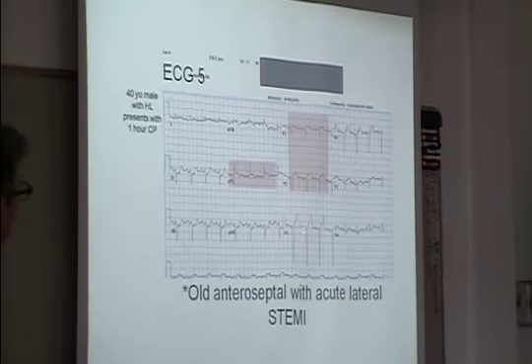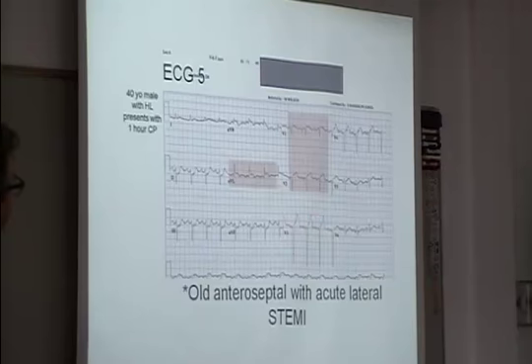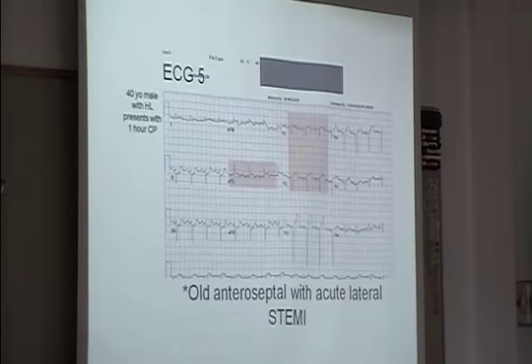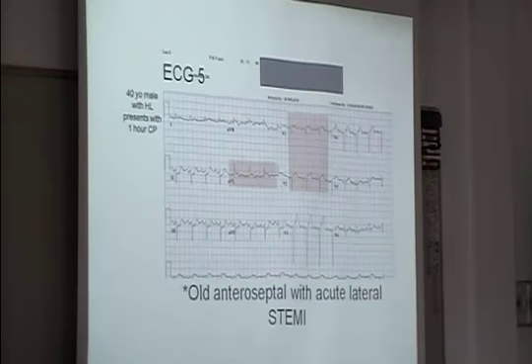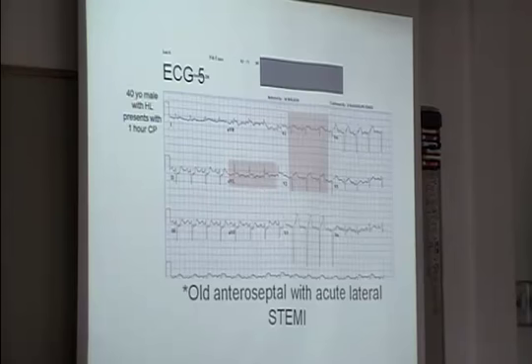So he's lost R waves here, and if this guy's a one-hour chest pain, he should not have lost his R waves across the precordial leads within an hour of his infarct. So that was a clue that he had an old septal, anteroseptal infarct, and now has these new acute changes.